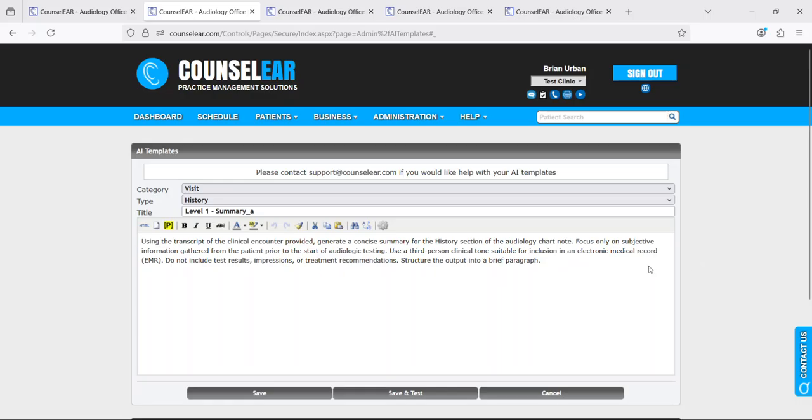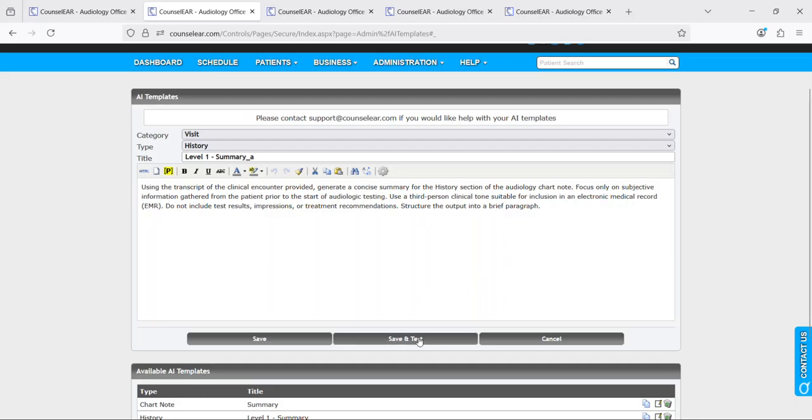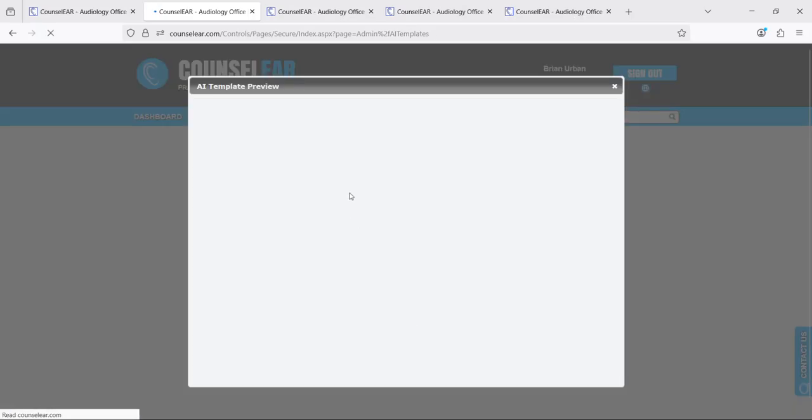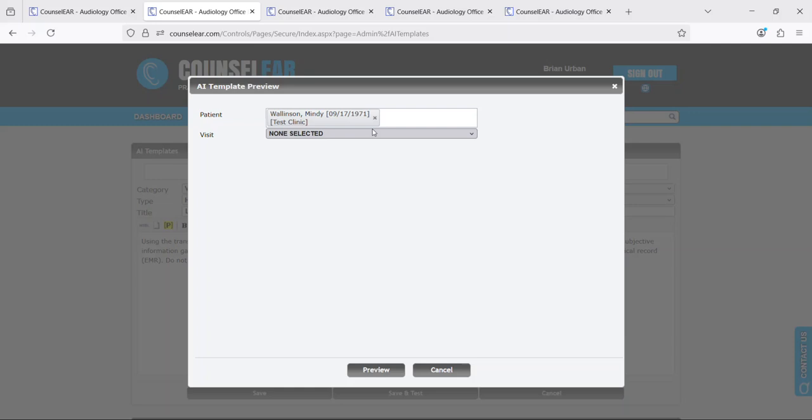But point being is if you have knowledge of prompting, this is an area of interest for you, you can absolutely create your own templates. And then without having to necessarily go back and forth and try to test these, you can test them right here. So you would simply just click save and test. It will then give you the ability to select a patient and a visit where you can test against.